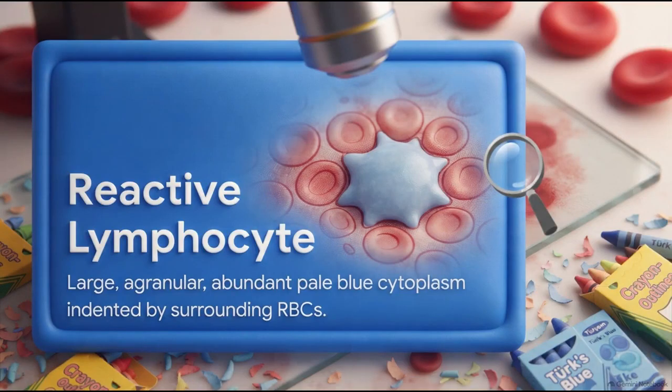We also have to keep an eye on the lymphocytes. A reactive lymphocyte, sometimes called a Türk or Downey cell, gets really large and agranular with abundant pale blue cytoplasm. A great mnemonic here is the Crayola outline. Because the cytoplasm is soft, it gets indented by the surrounding red blood cells, looking almost like it was colored in with a crayon. Keep in mind, reactive lymphocytes have a highly variable morphology, whereas malignant cells are rigidly uniform.